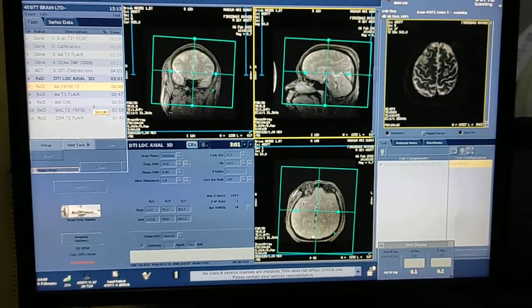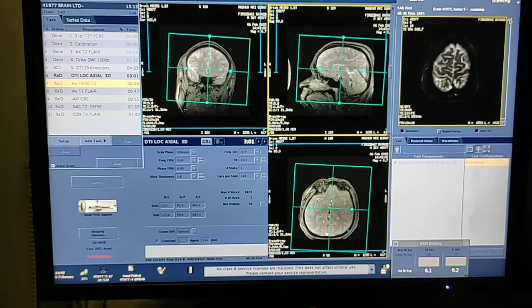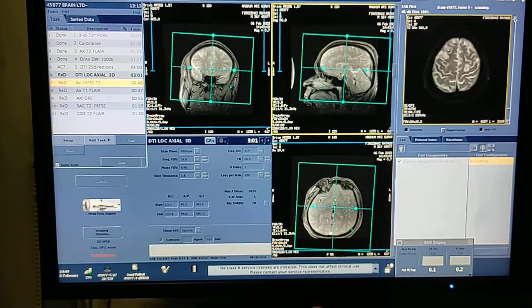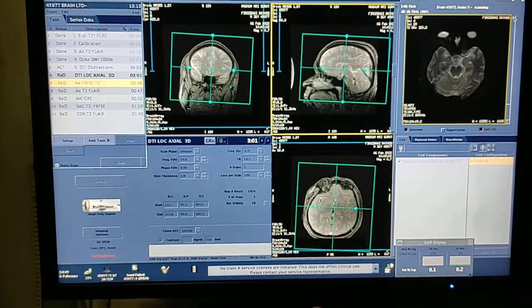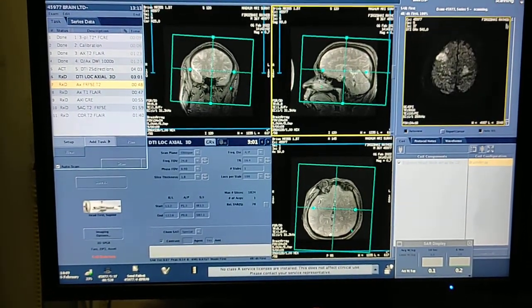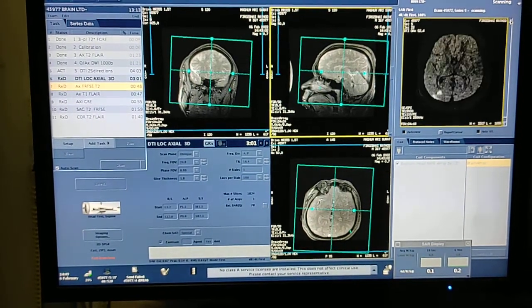The DTI sequence is running in 25 directions — it will take some time. One by one, images will be displayed.